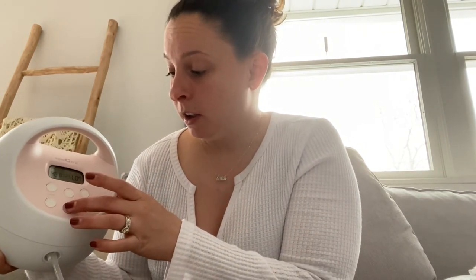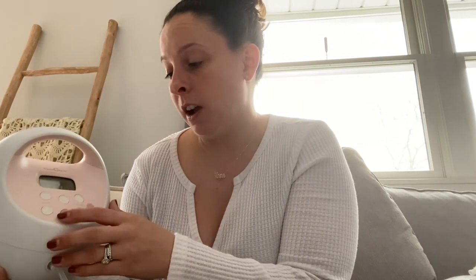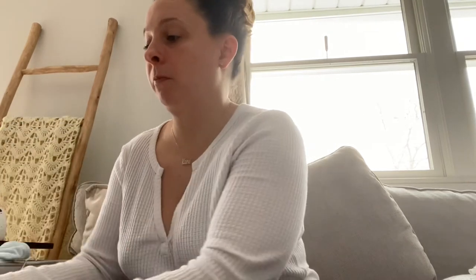Those are the settings to keep it on. When you first turn it on, switch over to stimulation mode and have that attached for 2 minutes, then push the wave button and go to expression mode for 3 to 4 minutes. You do that for three rounds — so about 15 minutes total: 2 minutes stimulation, 3 minutes expression, 2 minutes stimulation, 3 minutes expression — that works out to about 15 minutes.